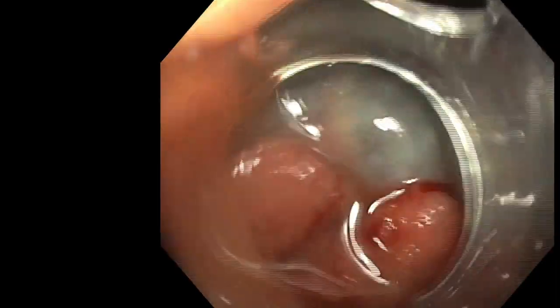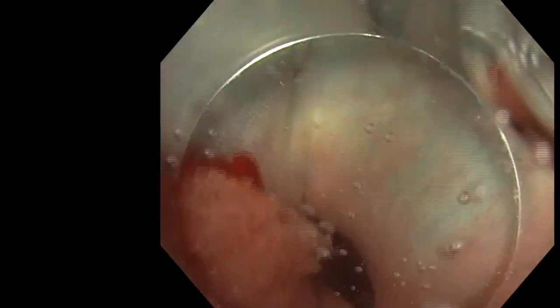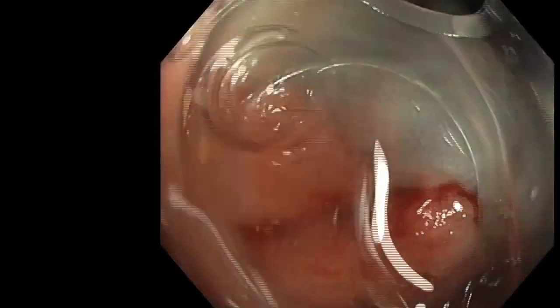I mean, it will be possible by doing a down position of your knife. You will be able to do both incision and trimming on the good edge.